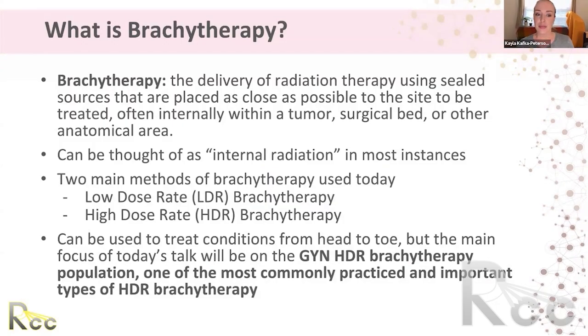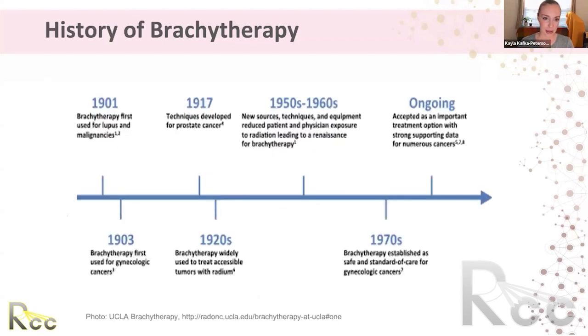Again, the two main types of brachytherapy that are used today, the most common are HDR and LDR. And these can be used to treat conditions from head to toe, but the main focus again today will be the GYN HDR brachytherapy or pelvic brachytherapy, which we care for the patients very similarly, prostate, GYN. But because GYN HDR is the most commonly practiced, we will have a heavy focus on that.